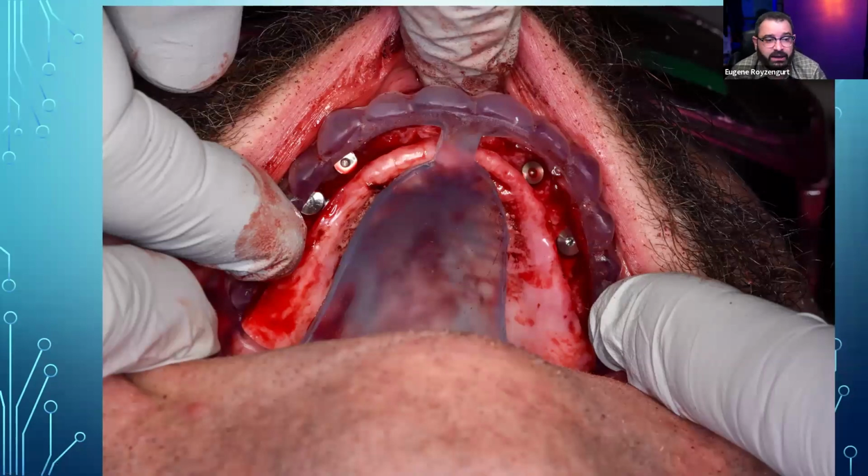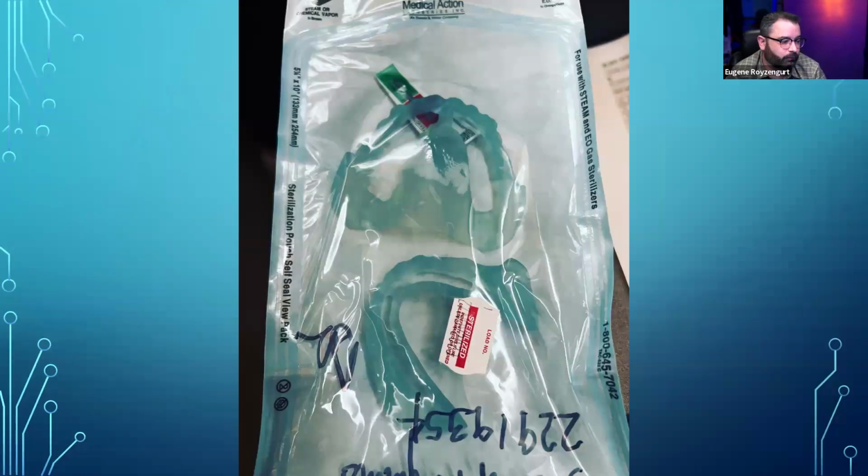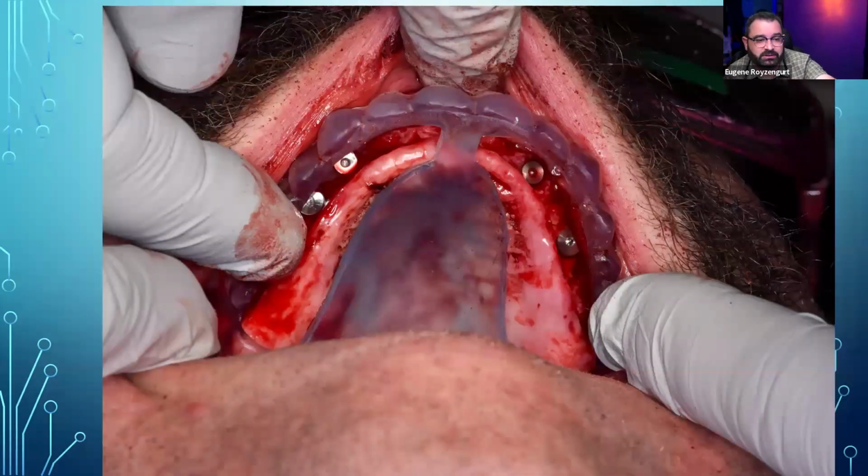Now, another great thing is that you guys should know, some resins you can actually autoclave and they don't disintegrate, they don't flake or anything like this. And this particular resin works out great. And you can see it's actually blue. It's got a blue tint to it. And the reason they did it in blue is because it's a lot easier to see if it's all the way down. Like you can see right here on the palate really well, that it's sitting all the way on the tissue.